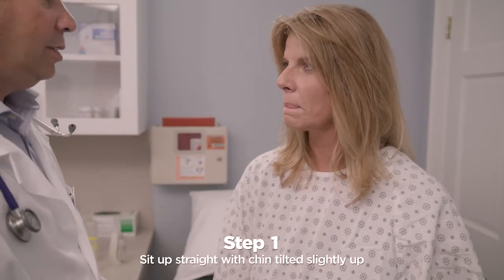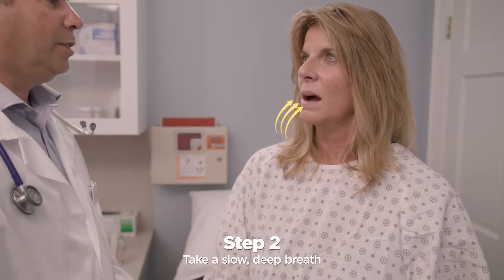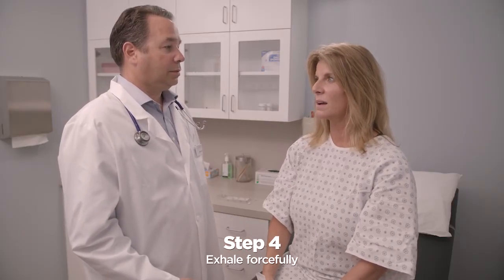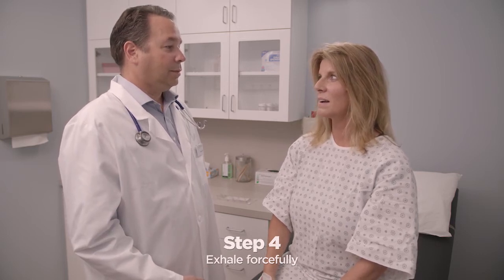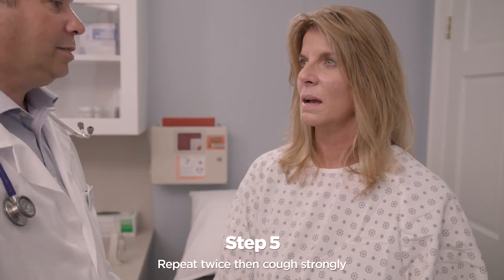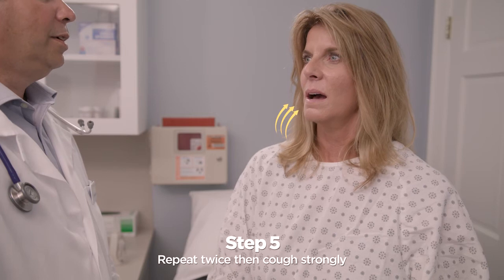Sit up straight with chin tilted slightly up and mouth open. Take a slow, deep breath to fill your lungs about three quarters full. Hold your breath for two or three seconds. Exhale forcefully in a continuous exhalation to move mucus from the smaller to the larger airways. Huffing is like exhaling onto a mirror or window to steam it up.